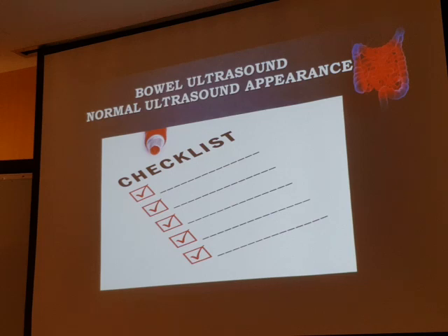You have to collect information to provide a positive case or a negative case. You will receive a request asking about a disease. Is it in or is it out? So you have to have proper information, proper data. You are the one gathering it and giving it to the doctor to have a proper diagnosis. If the doctor has a proper diagnosis, that means you are a good sonographer because you are giving them the proper information. So to say it's a healthy bowel examination, what is your checklist?